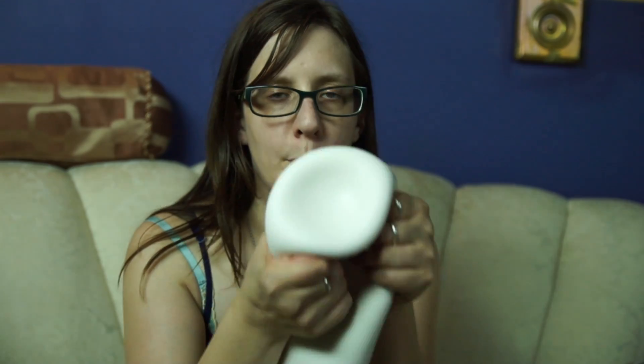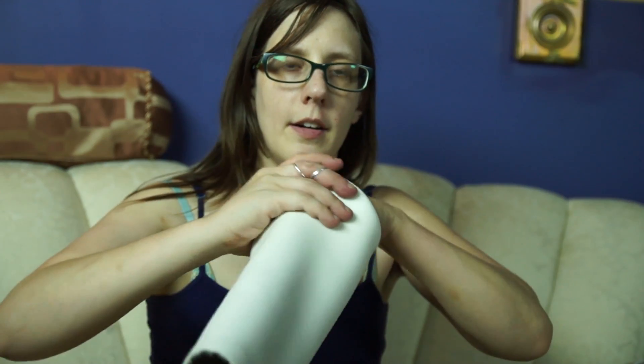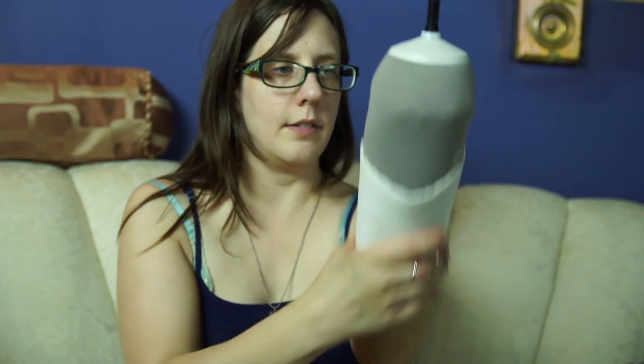The way you put a liner on your residual limb is you take the liner and turn it inside out. You press the end of the liner all the way against your residual limb, and then you roll the liner onto your leg — kinda like this.